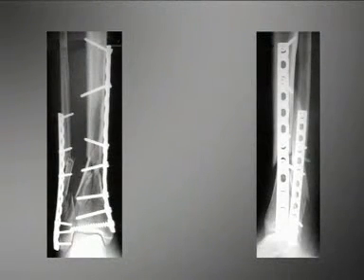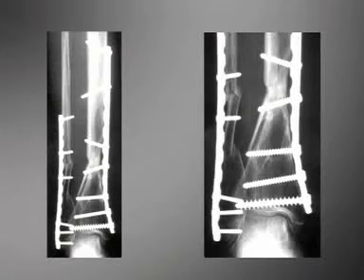These are the post-operative X-rays of the 55-year-old patient. The internal fixation was carried out with conventional LC-DC plates. X-ray follow-up after 3 months shows the unchanged position of the fracture and the onset of indirect healing.